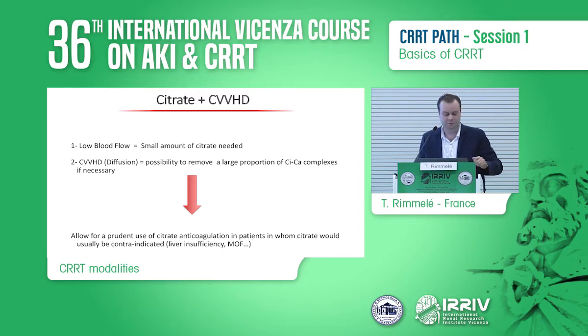But by doing this, if you work with low blood flow rates, with a low amount of citrate given to your patient, you can push the limits, the indications of citrate anticoagulation in your ICU.